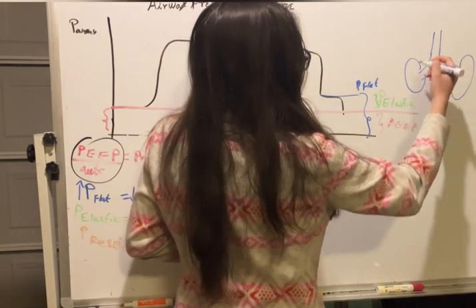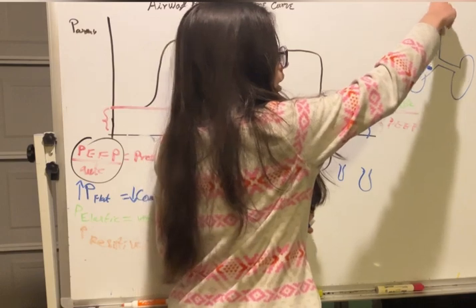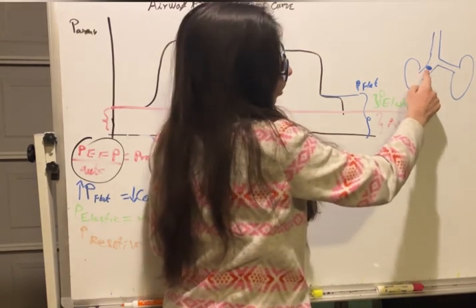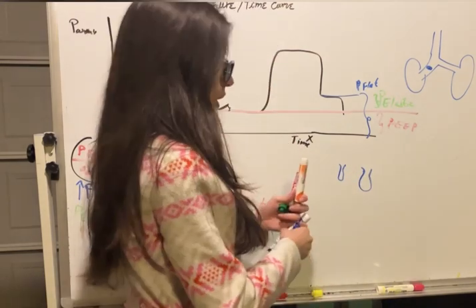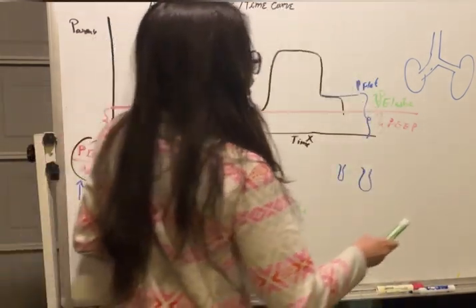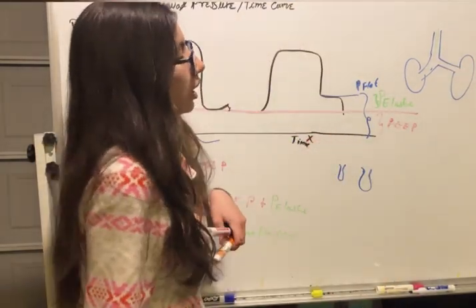If we have, for example, a mucus plug in here, we are going to have resistance for air entering the alveoli. As air comes in the trachea and then to the bronchi, if we have this mucus plug, this is generating resistance for air getting inside. Or if we have a very narrow endotracheal tube, this generates resistance as opposed to a larger endotracheal tube.